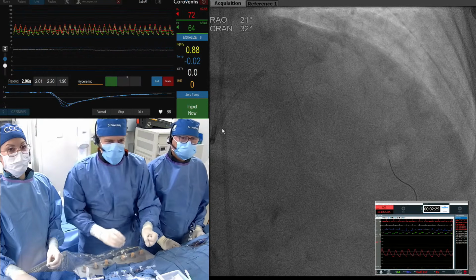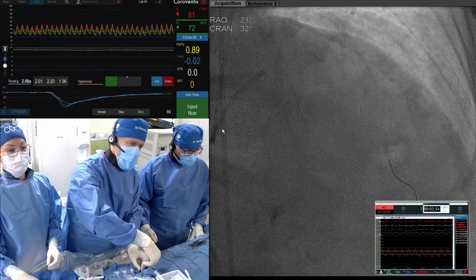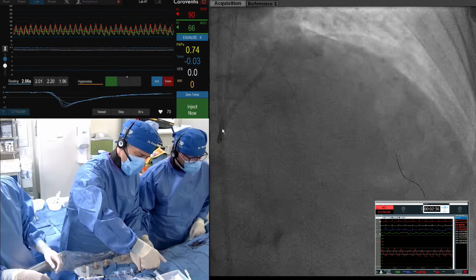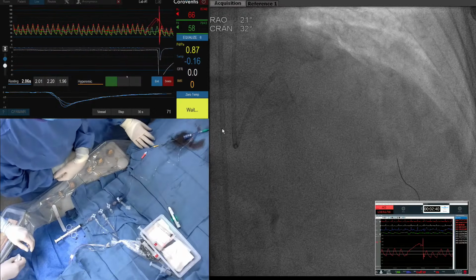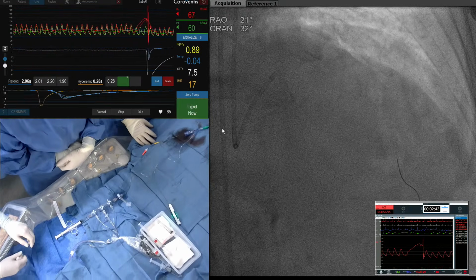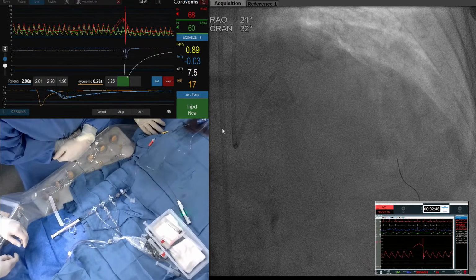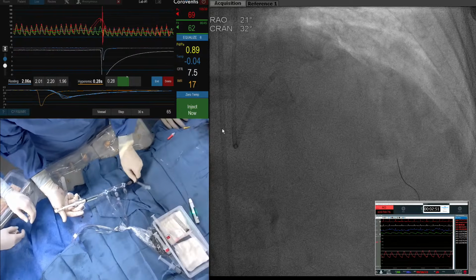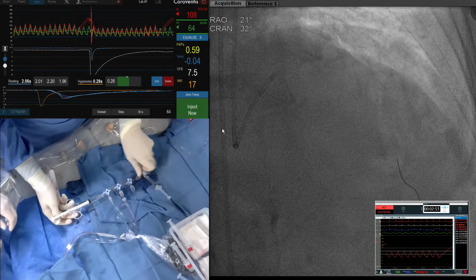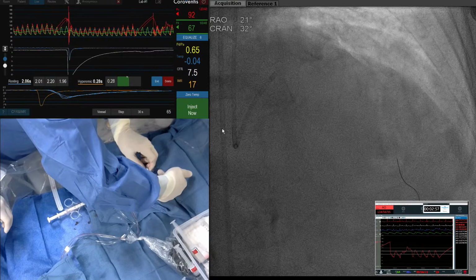All right. I think we're probably pretty close here. I'm going to go ahead and do a hyperemic injection. If we can focus on Dr. Sweeney's hands, he's injecting the 3 cc's now. What you notice already is that blue dip, that's more of a dagger as opposed to that slight round. And look at that shift to the left. Pretty remarkable. So I do think we are hyperemic. Your orange line all the way at the bottom, that's your hyperemic transit time, is way over to the left, like you said.